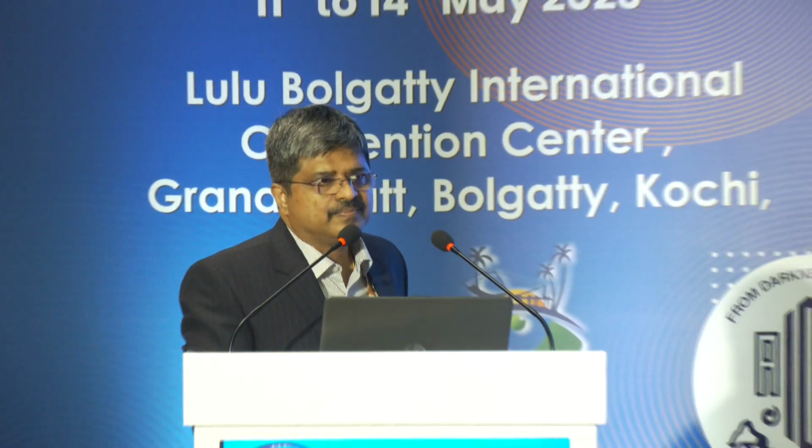Non-valve devices, we have also not done many, Devendra. We've had hypertensive phases, but they were covered by anti-glaucoma medications, maximum over a few weeks, and then we could taper the medications.